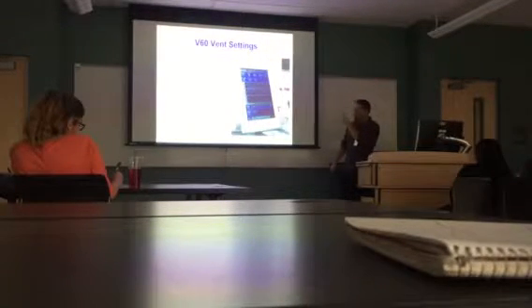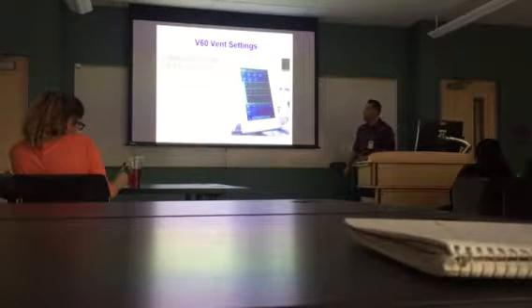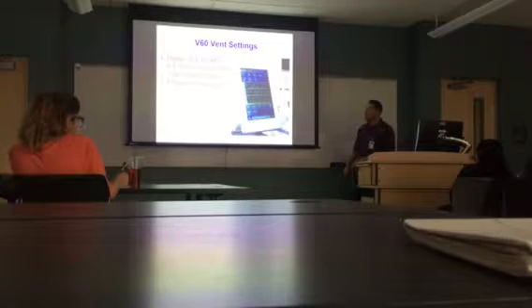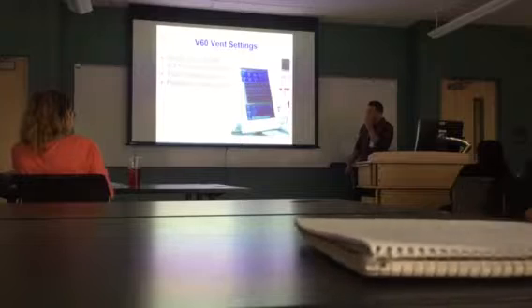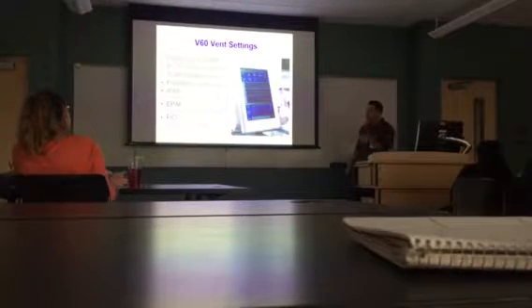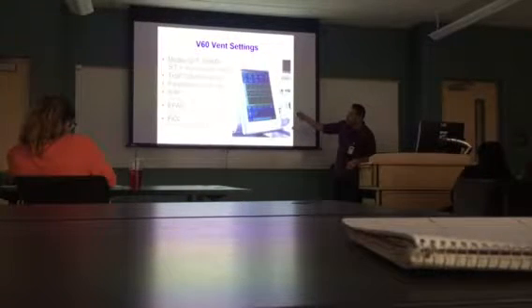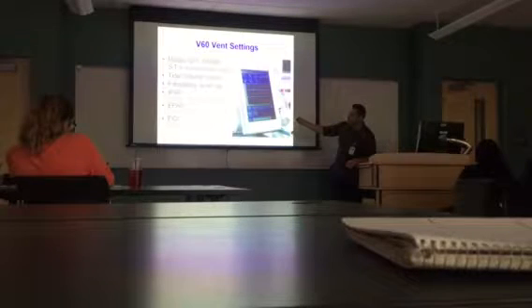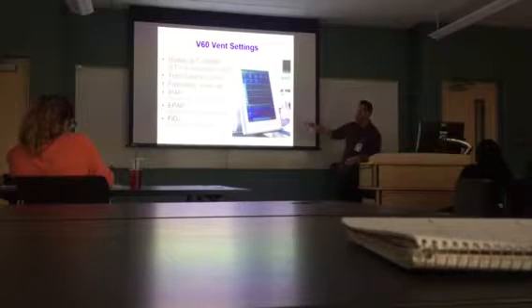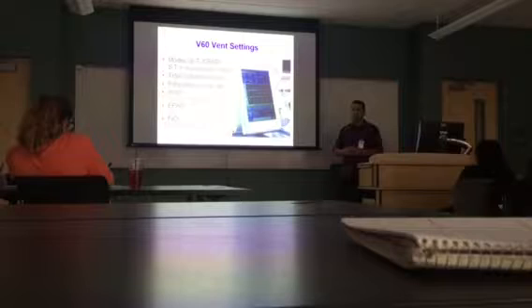Now notice the ventilator settings for non-invasive ventilation. You'll see they are very similar: tidal volume, frequency, IPAP, EPAP, and FiO2. So here you know what the tidal volume is, the rate. IPAP is inspiratory positive airway pressure, and EPAP is expiratory. EPAP is the same as saying PEEP, only it's on a non-invasive ventilator. That's it.